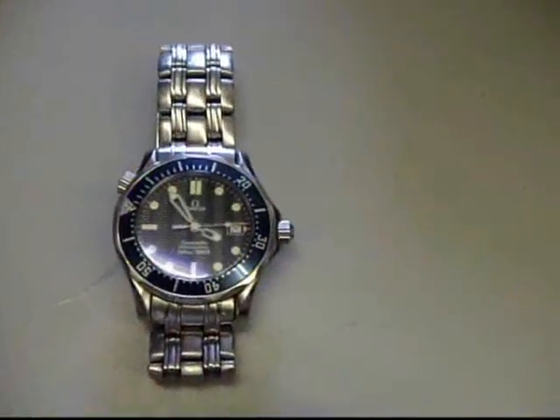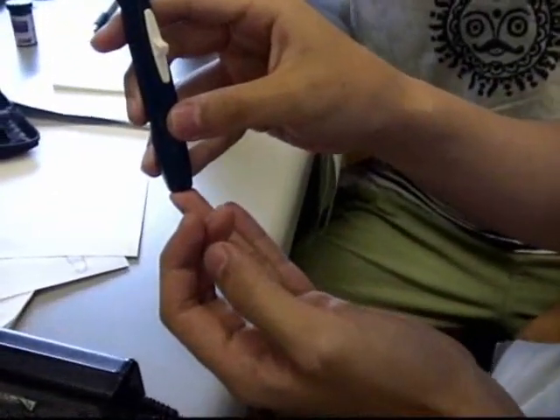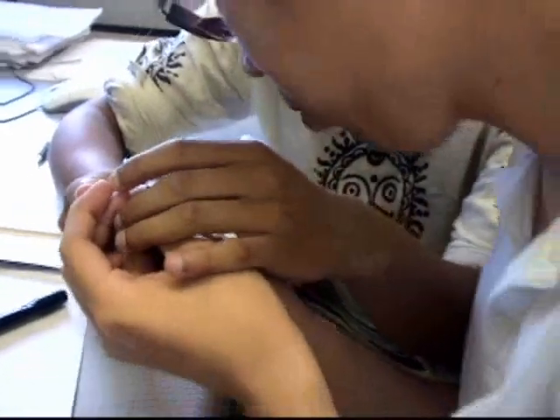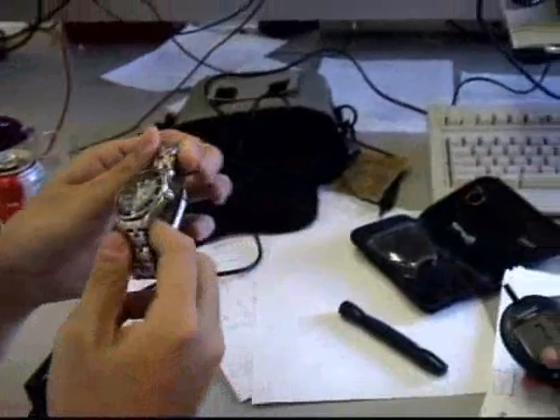It's 3:55 now. We're going to take our third measurement. There's quite a lot of blood coming out. It reads 7.7 millimoles per liter at 3:55.